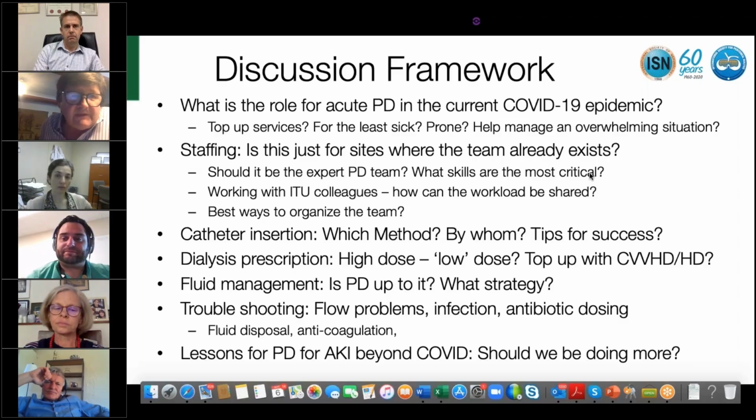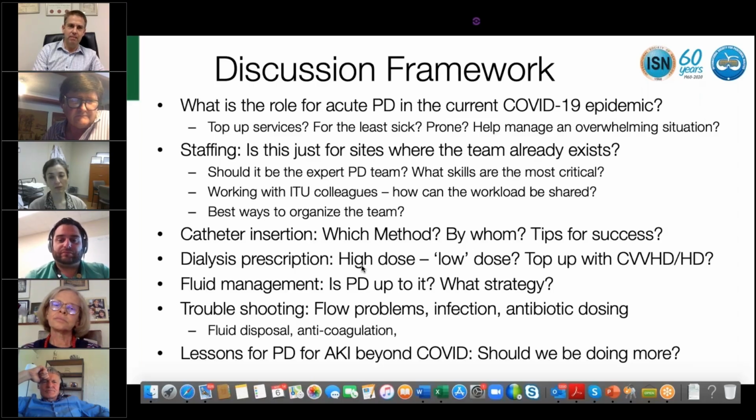Brett, do you want to comment on that in terms of your wider experience? Yeah, so we will start with 2 liters as a full volume. In most of our patients, if they're small patients, we'll go to 1.5 liters. So we tend to start quite high, but we haven't had problems with that. We don't very often see a leak either. And I think leaks are patient dependent or person dependent. I don't think you can predict it on volume, and there's data to support that.